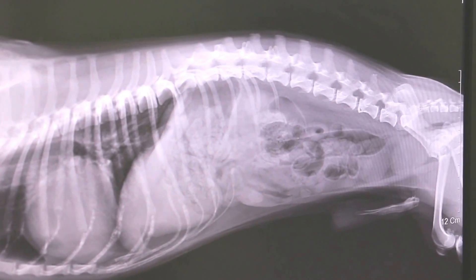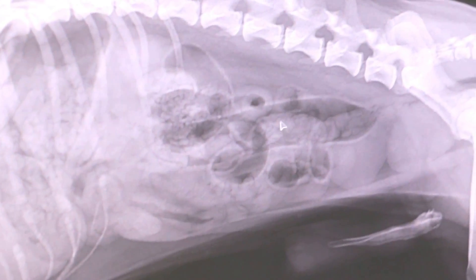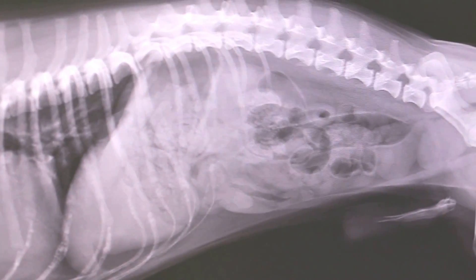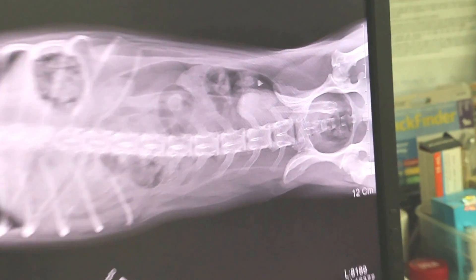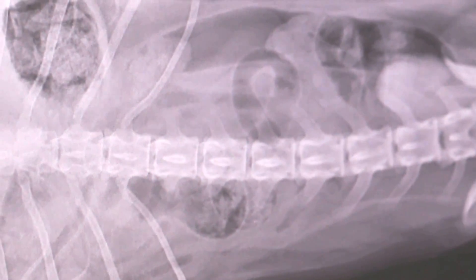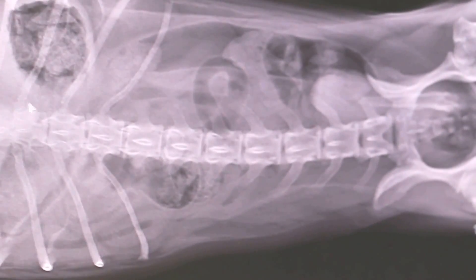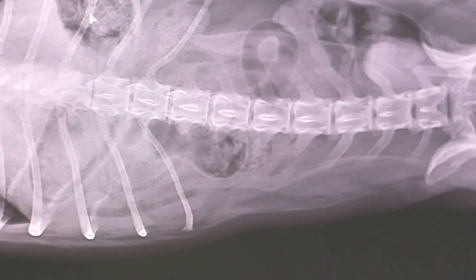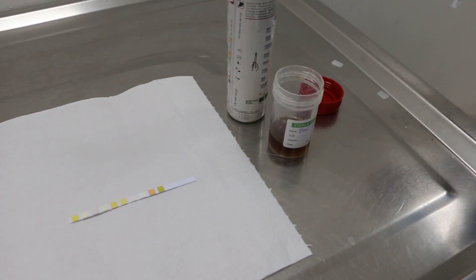Now I'll show you a normal dog with no constipation for comparison. When there is no constipation, you cannot see the colon impacted — the colon will have more gas. So you can see there is no impaction of the stool. The stomach can be seen clearly with food still in it, so the dog is still eating — nothing wrong.